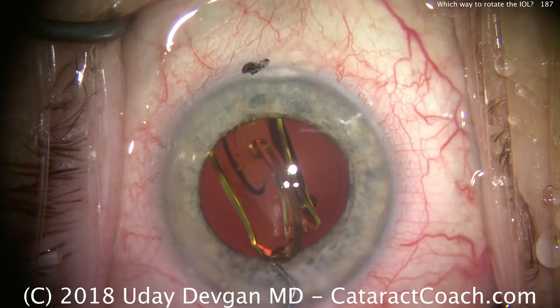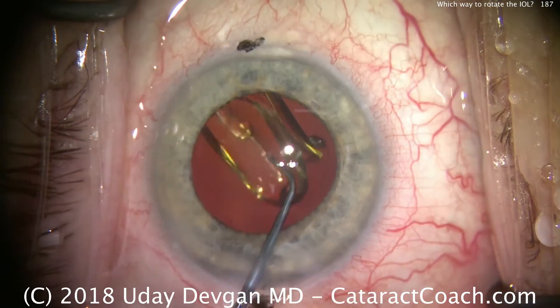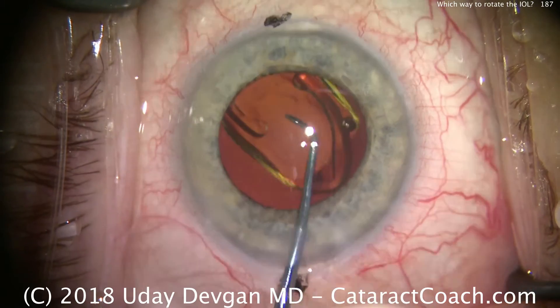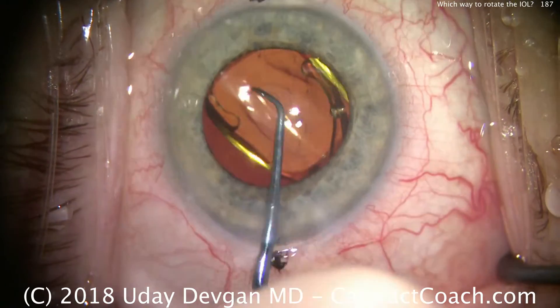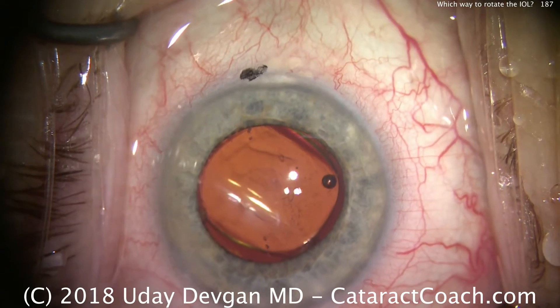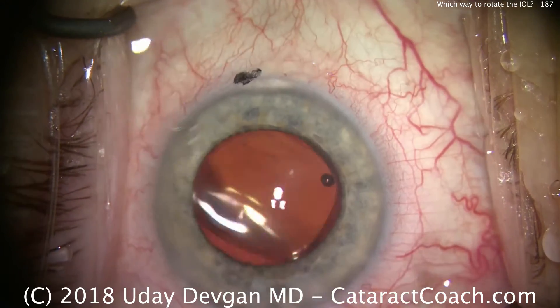So here we can go inside and rotate it counterclockwise very easily. But once the arms — the haptics — unfold, they may get caught up in the equator of the capsular bag if we rotate continually counterclockwise.